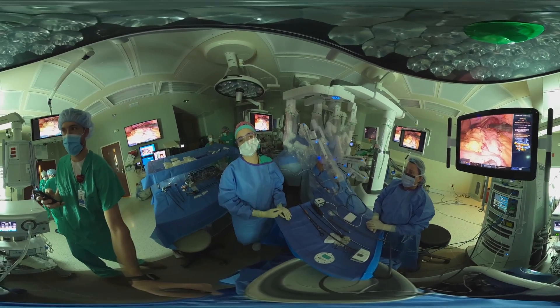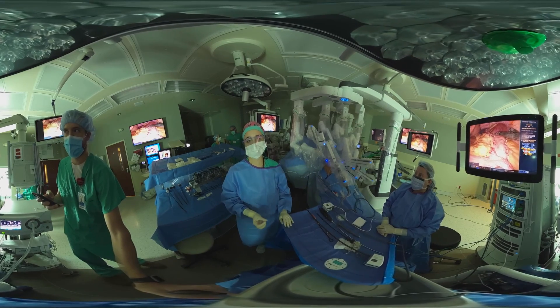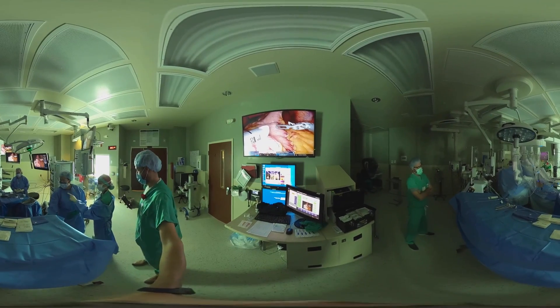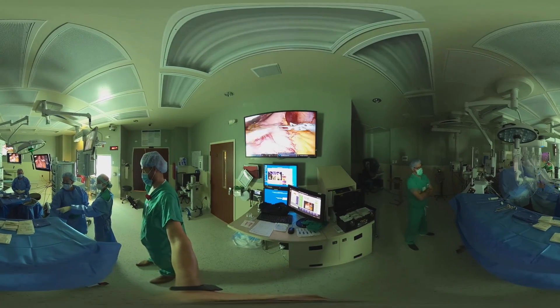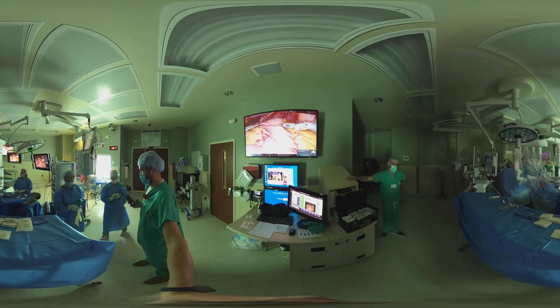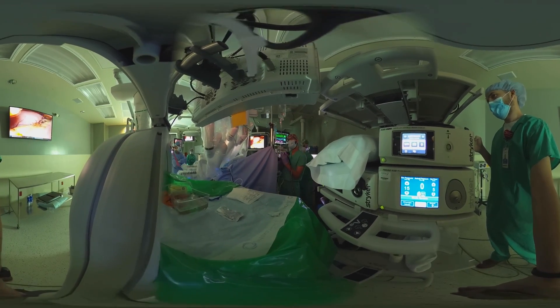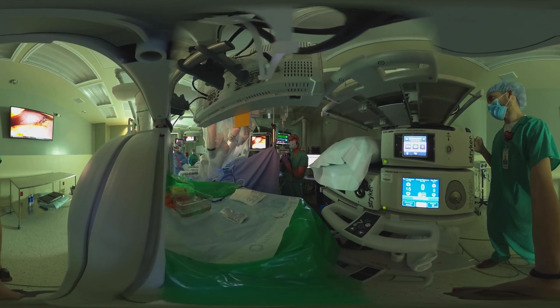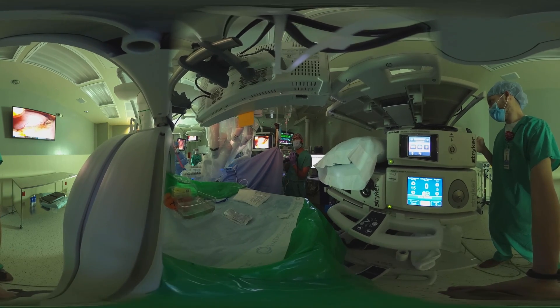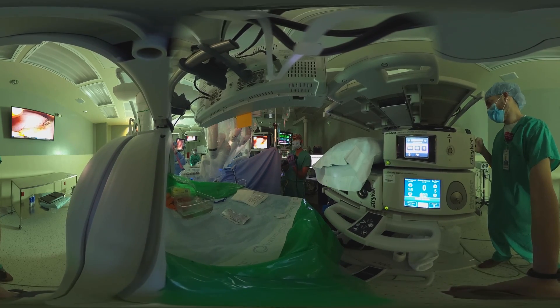Right now we're about to fire the first staple line on the stomach. We'll advance the bougie to see how far the staple has been placed. We're making sure that the sleeve looks adequately shaped on the inside, that it's a good size and caliber, and that the staple lines are nice and straight. So far it looks like a nice straight little cylinder — if that's confirmed, then we're done.